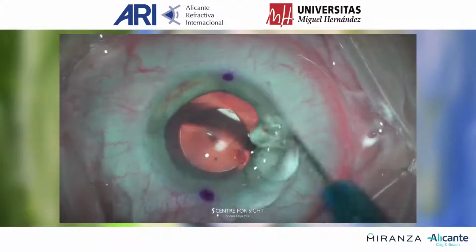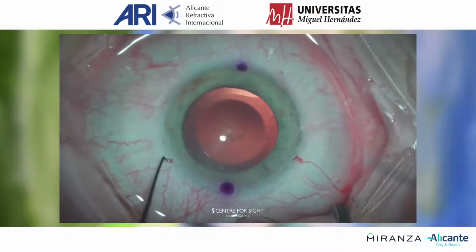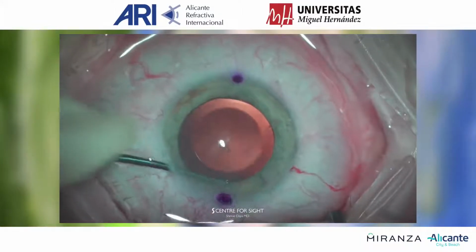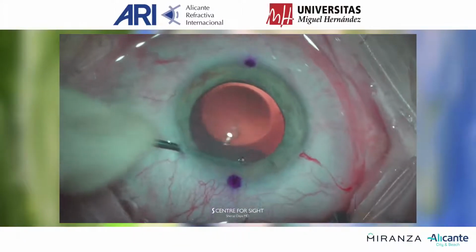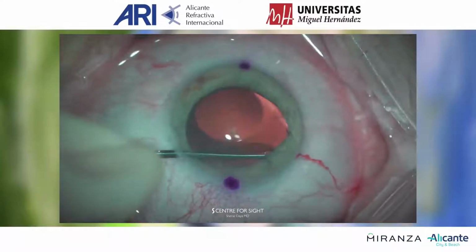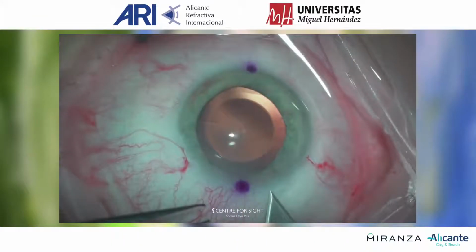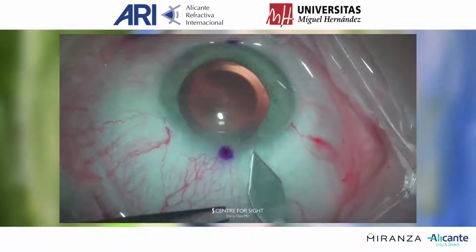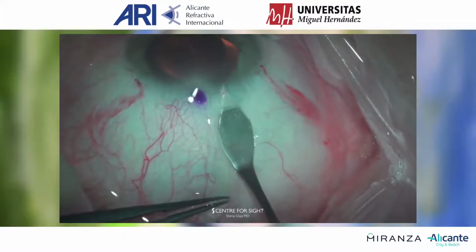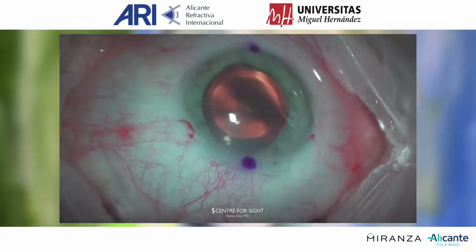This is methylcellulose on the surface of the eye. A Lester pusher is used to prolapse the haptics of the ICL into the anterior chamber. The incision is being made, which is a 3mm incision. This is a small poke in the cornea to hydrate the cornea following surgery. The transconjunctival incision is made.